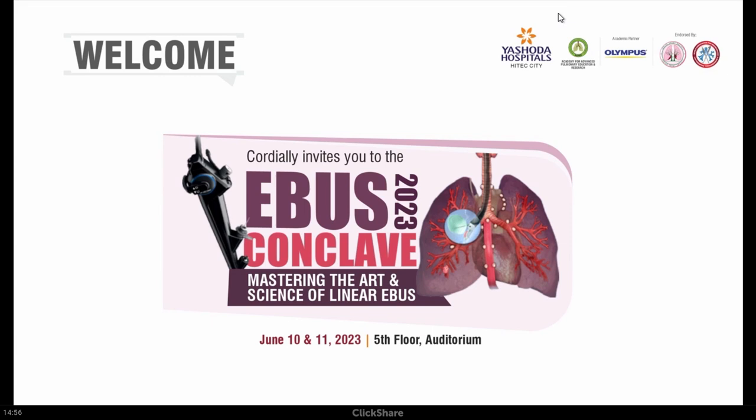So what we do is we do EBUS TBNA. So always TBNA, with either a 21G or 22G needle. It doesn't matter which needle you use. And we do ROSE. So not PROS, not WhatsApp ROSE, it is ROSE. So we have a pathologist, so we do ROSE. So we ask two things: what is the probable diagnosis and what is the material adequacy.